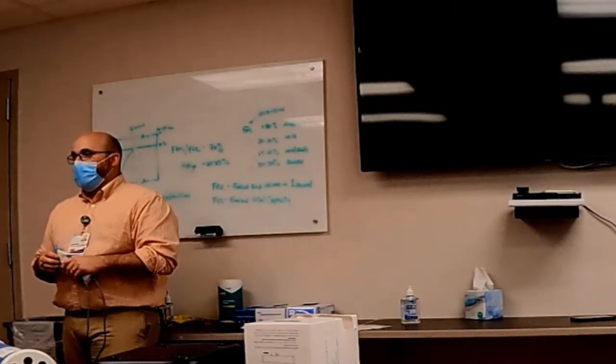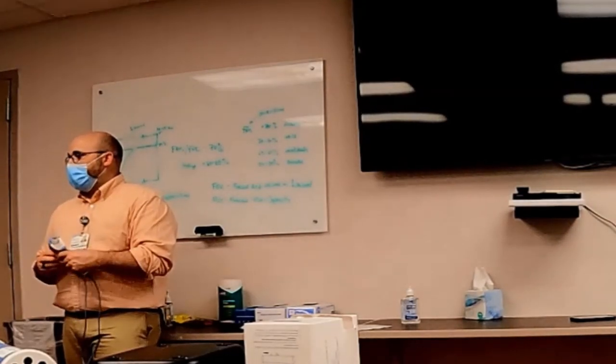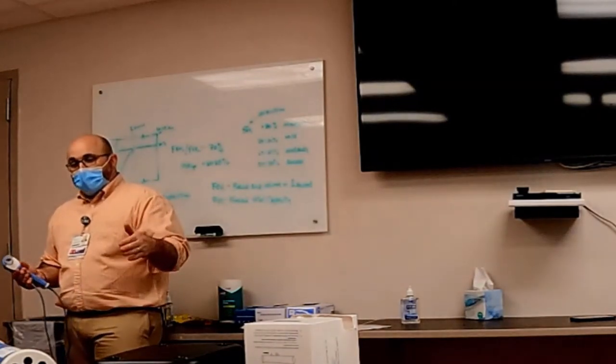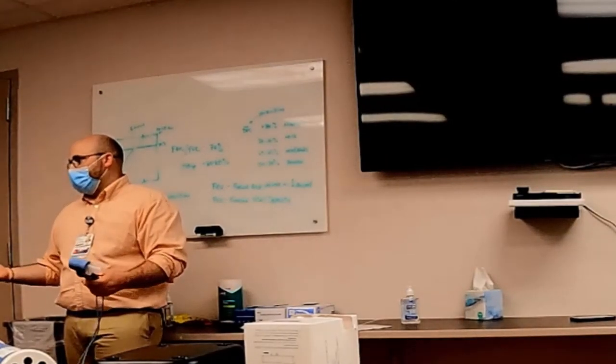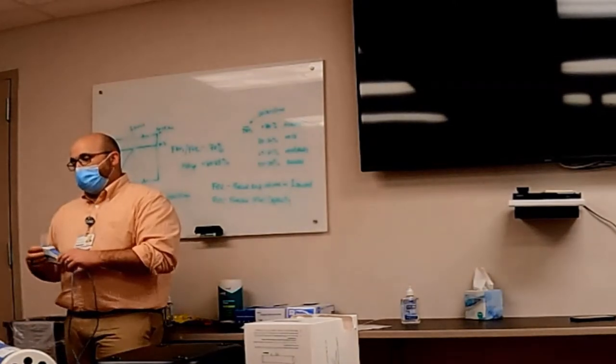And then it's nice to know what kind of medication it is, because that will affect it. So if they just got started on Spiriva 2 months ago, it would be nice to show that they've been on Spiriva for 2 months to see if it's done anything. Just a review of what the medications do.